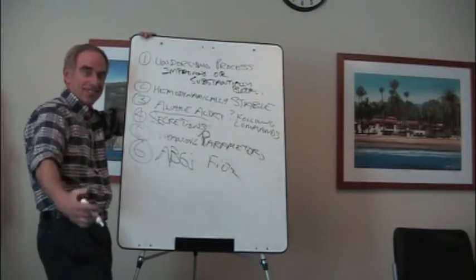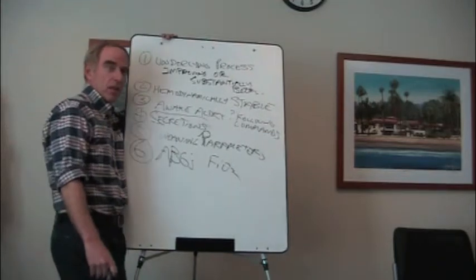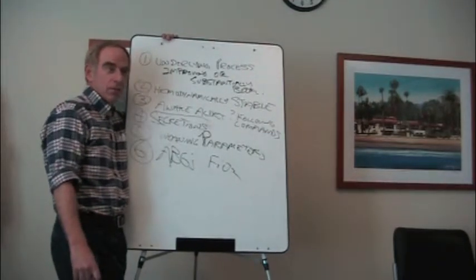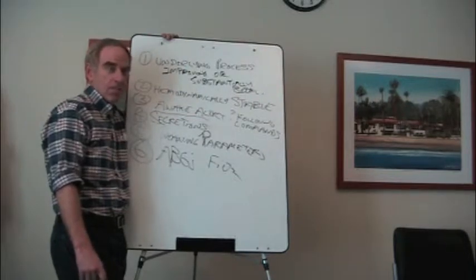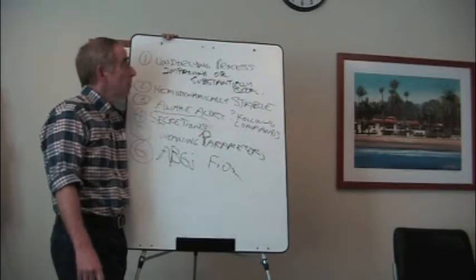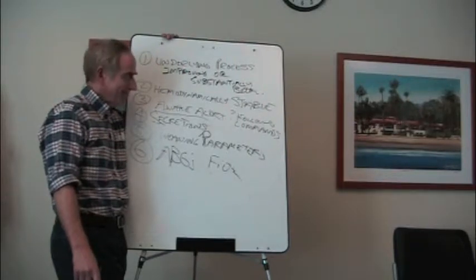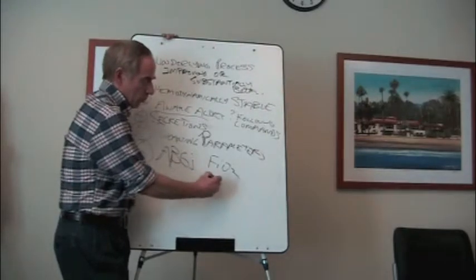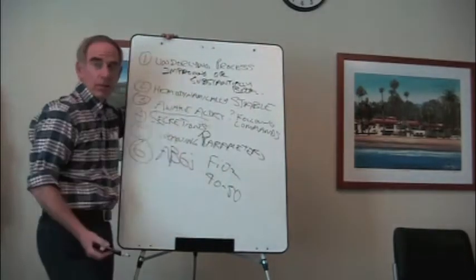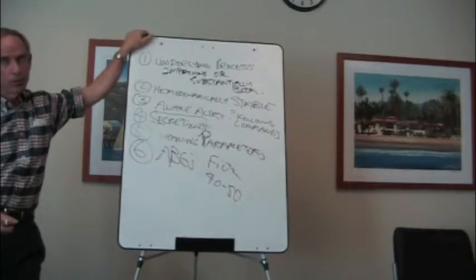Karen, want to weigh in on this? Sorry, I was trying to write down the last. Minimum acceptable FiO2 that you would extubate somebody from. 35? Well, it's probably somewhere between 40 and 50 usually. Almost never above 50, pretty much never above 50.